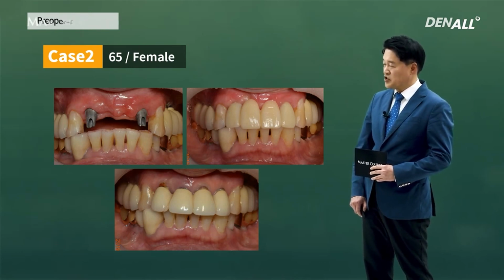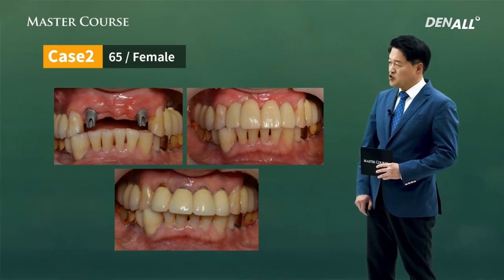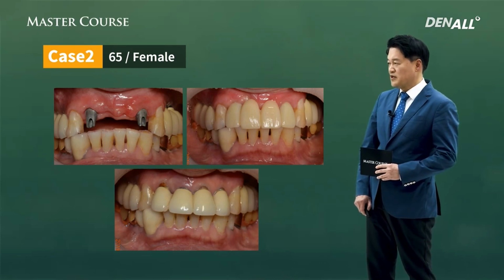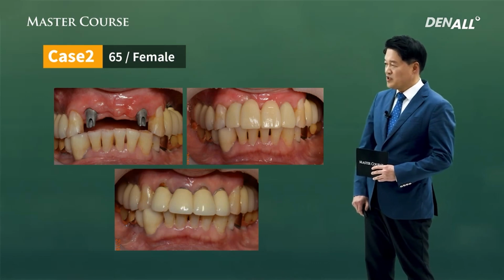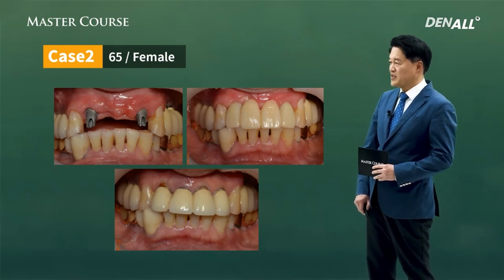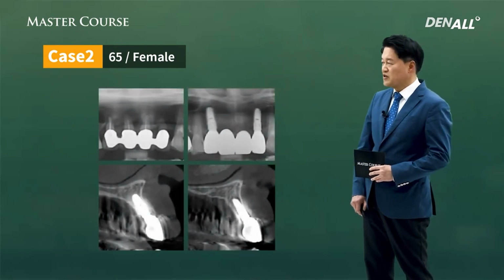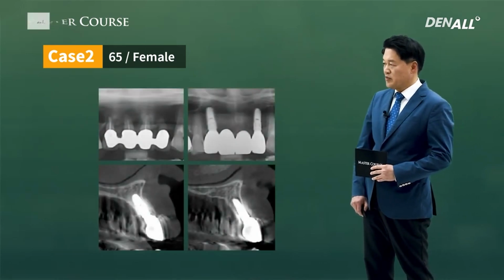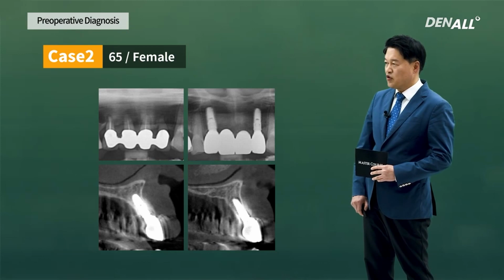and the prosthesis was completed. As you can see, by recording a post-op image, you can see that compared with a pre-op image, the results are much more aesthetic, and you can share that with the patient and gain the trust of the patient, and patient satisfaction can go up. The X-ray was taken to compare before and after, and on CT, the GBR area on the buccal side is healing nicely.